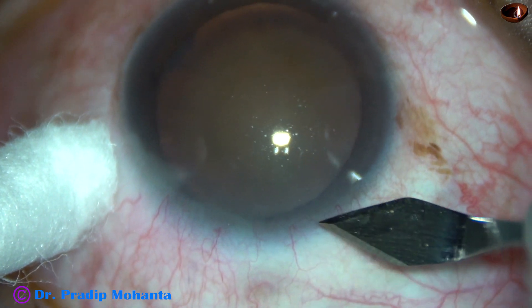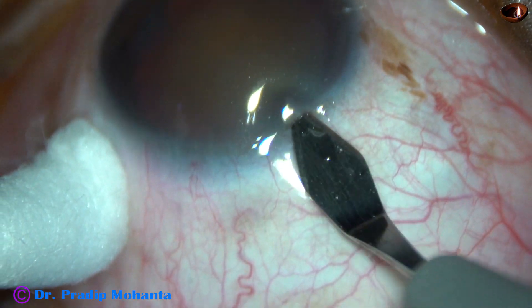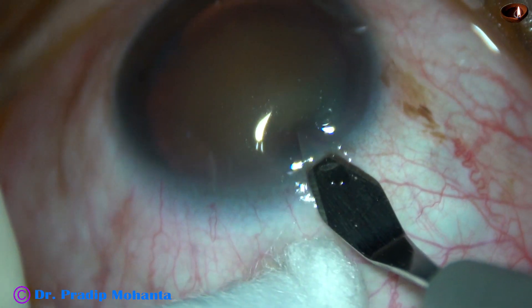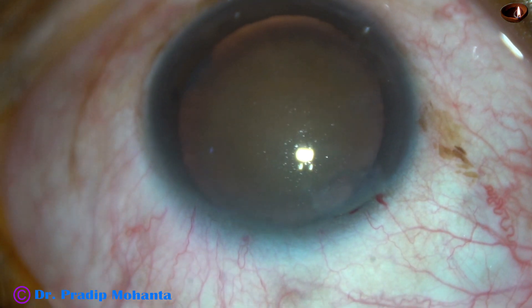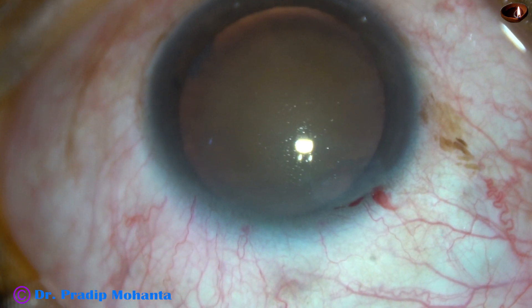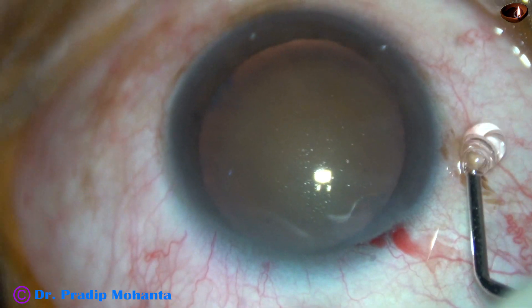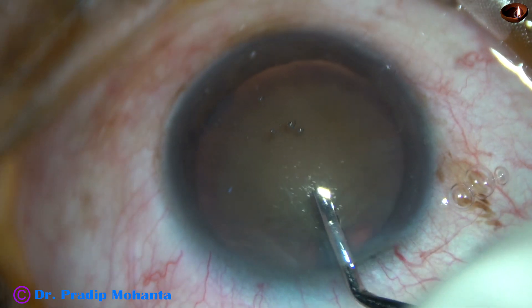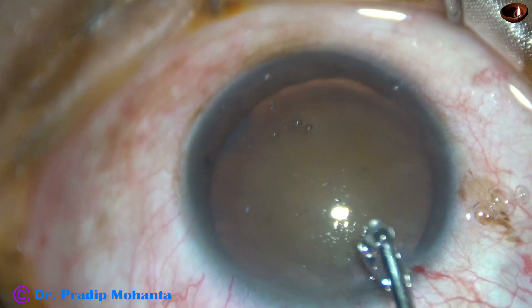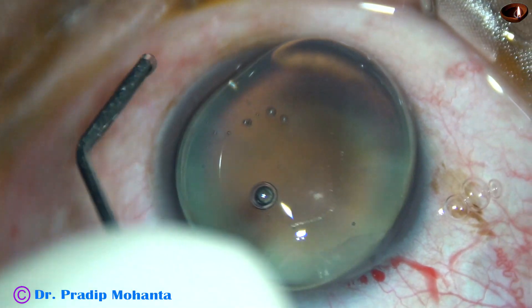This is the main incision with a 2.8 mm steel keratome at the mid-limbus. Now, 2% hydroxypropylmethylcellulose is injected into the anterior chamber and it is applied over the corneal epithelium for better visibility.